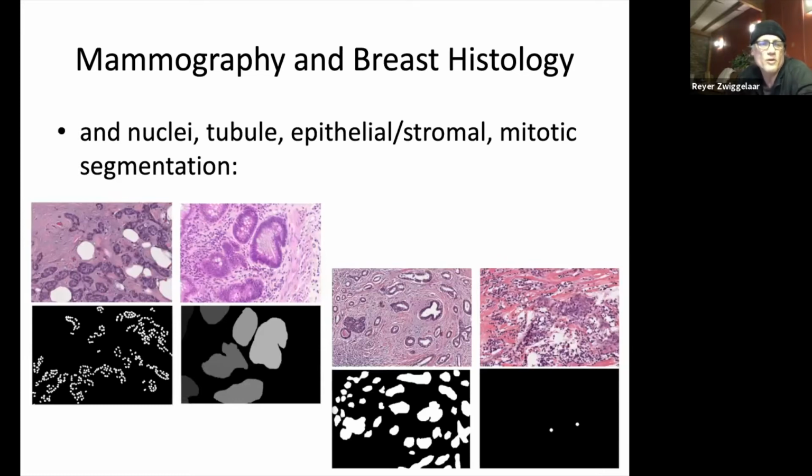So we've done quite a bit of work on segmentation of these images and picking up different aspects of that. And these aspects are basically things that a histology expert would find in the image as well. Basically, they would be counting small dots or larger dots, and they would take that into account in their classification.